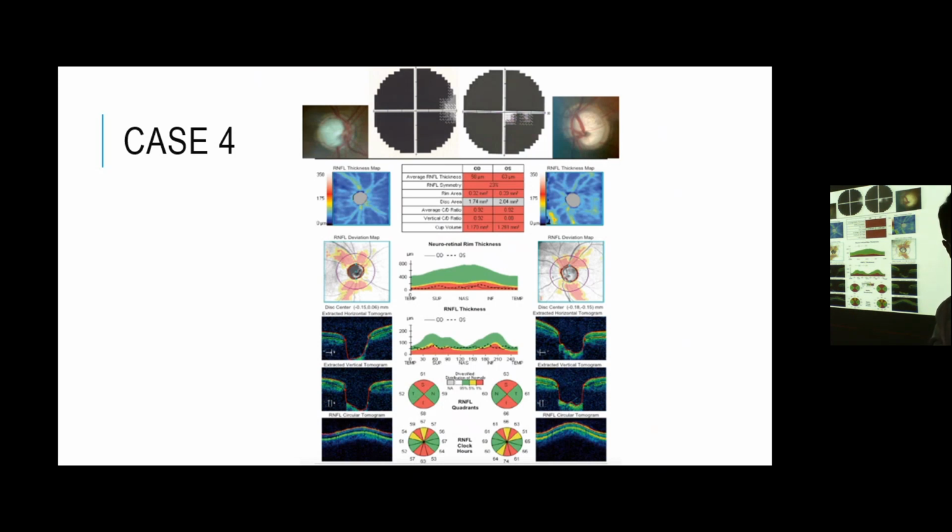In this case, do you want to follow him up with OCTs, or is it to follow up the patient clinically, with OCT and visual fields? Okay? But what do you think? The thinning here is very thin. Do you think 50, 60? Do you think the OCT will be helpful in this case? I don't think so.